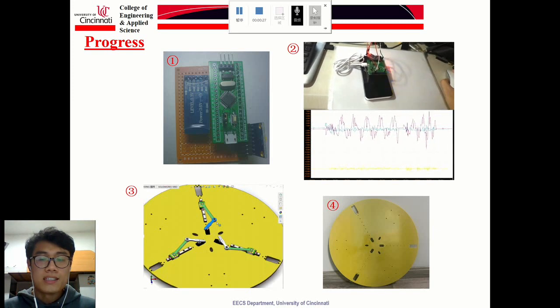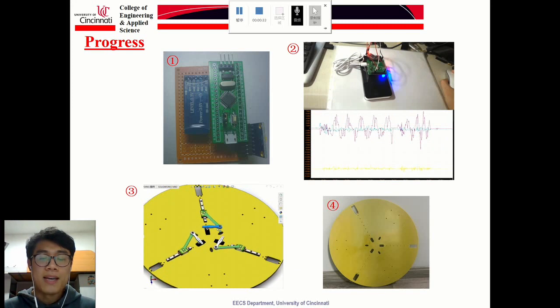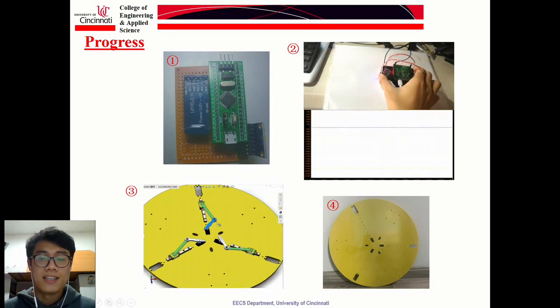The third video is about a chest simulating device. It's a simple linkage mechanism and can simulate the movement of the chest by controlling motors. We're trying to process and assemble this device. We have both the guides and slides, the servos, and even the fiberglass board. In figure 4, we drew its drawing and contacted the processing factory to make this board. The current progress is definitely good, and we are confident that the project can be completed in this spring semester.